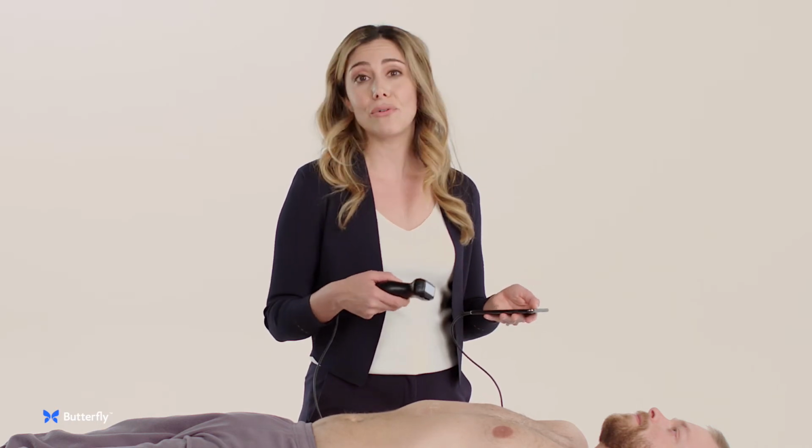So in just a few minutes, you've figured out why your patient is hemodynamically unstable and are able to direct your care. That's how I use the Butterfly iQ when I'm in the ICU.